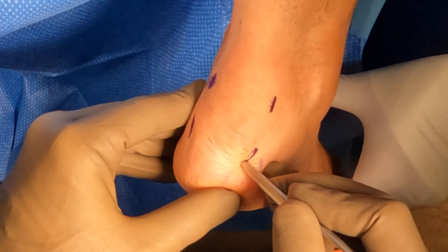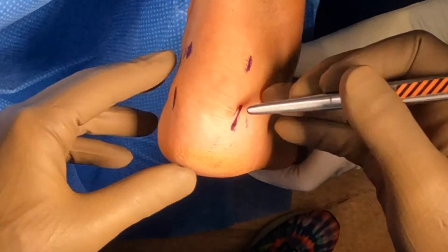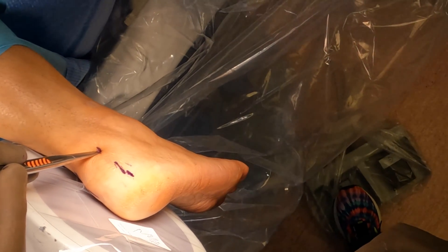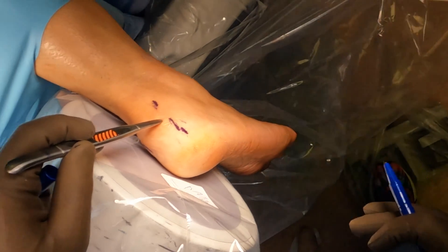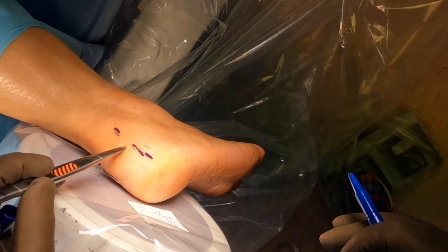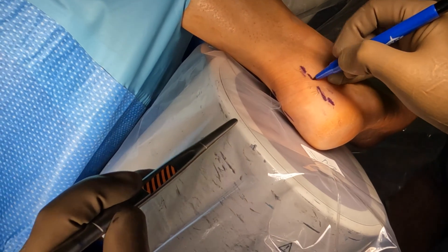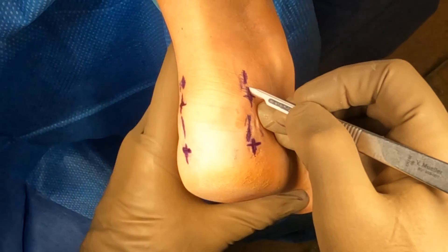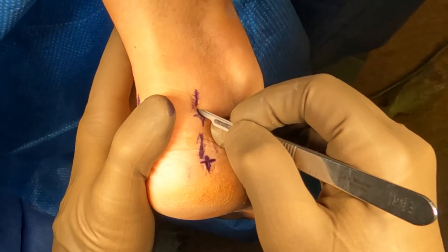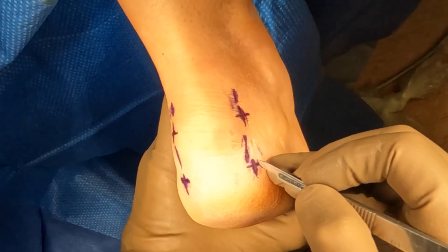This is a new technique available from an orthopedic company, Arthrex, that allows us to gain access to the back of the heel to remove a retrocalcaneal exostosis, which is nothing more than a large bump growing on the back of the heel. We can also remove some of the intratendinous Achilles calcifications at the same time, and if the patient has what's known as a Haglund's deformity, which is a large bump occurring on top of the heel bone, we can also gain access to it and remove that as well.